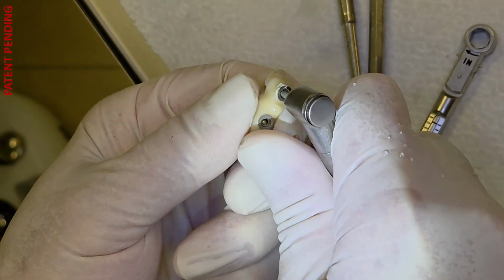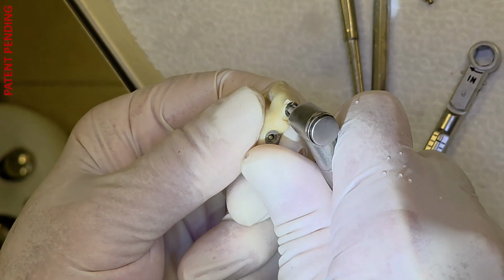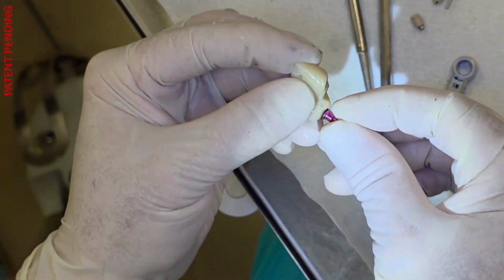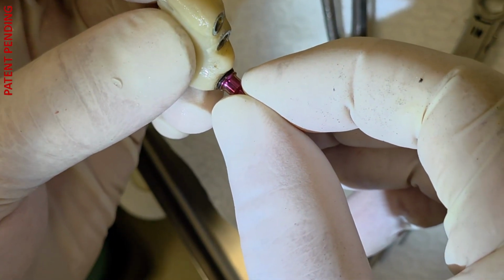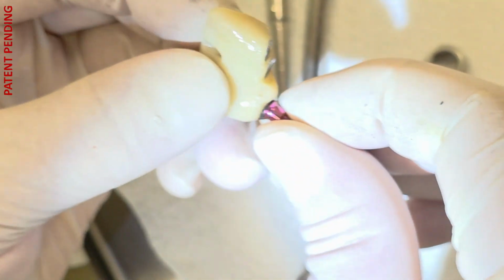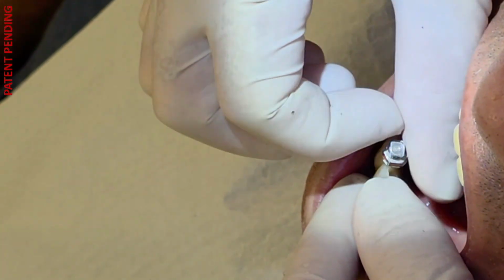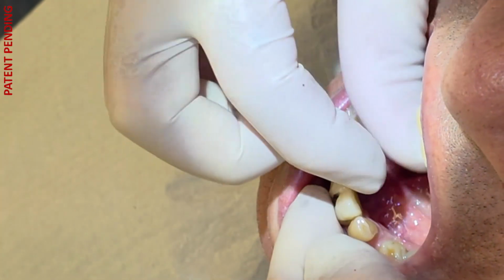Therefore, I take a diamond burr shaped like an olive and create a small recess in the bridge sleeve. Then I try in the Crest Fit multi-unit. Its height matches the previous multi-unit. After that, the bridge is placed back. The bridge is fixed with just 2 screws, exactly as it was initially with the temporary bridge.